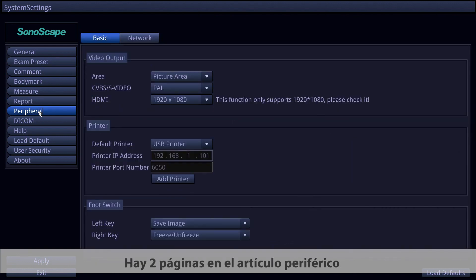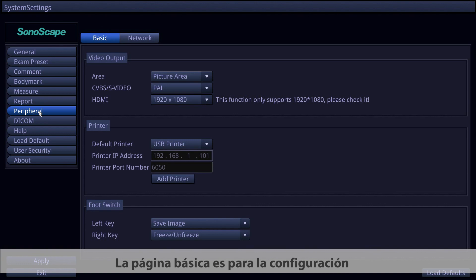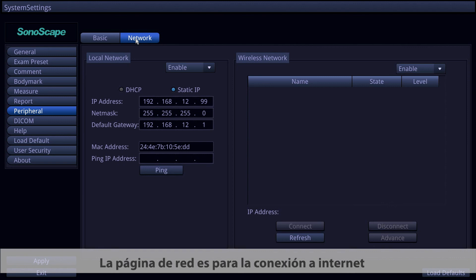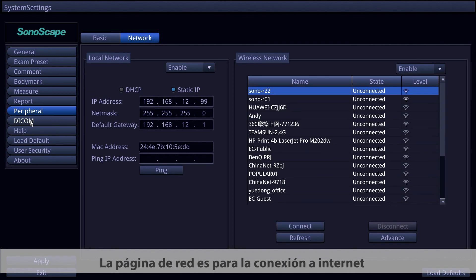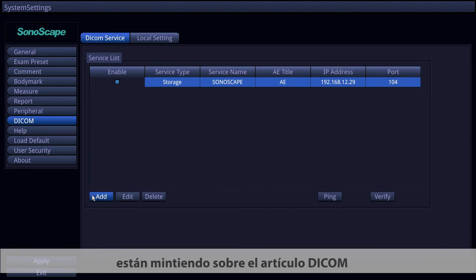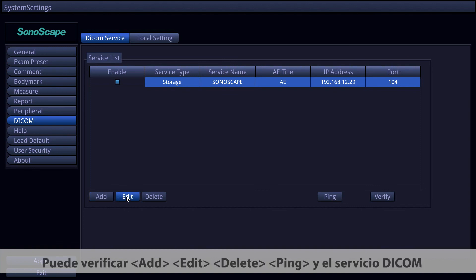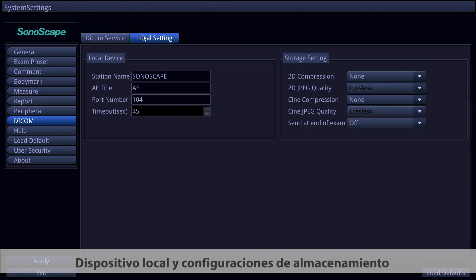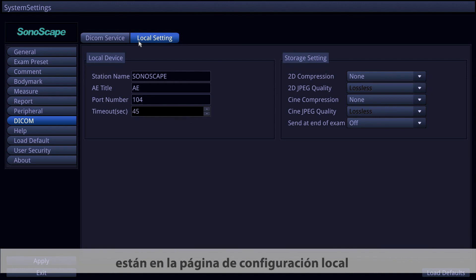The Peripheral item has two pages: the Basic page for video output, printer, and foot switch settings; and the Network page for internet connection. DICOM settings, including service and local settings, are in the DICOM item. You can add, edit, delete, ping, and verify DICOM services on the DICOM Service page, while local device and storage settings are on the Local Settings page.